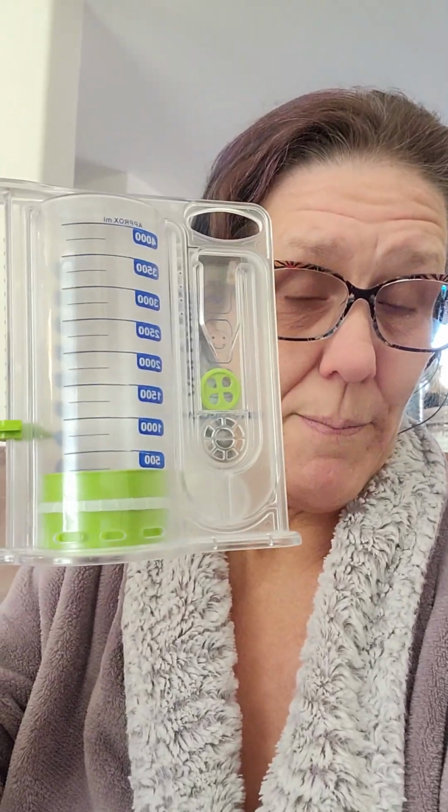So 5 days ago I was finishing up surgery, 5 hours colon resection, and I've been out of the hospital for 2 days. And one of the things that I'm doing that is a helpful thing to implement for healing and to prevent pneumonia and blood clots is using an incentive spirometer. It's a little device that exercises your lungs and helps you deep breathe properly.